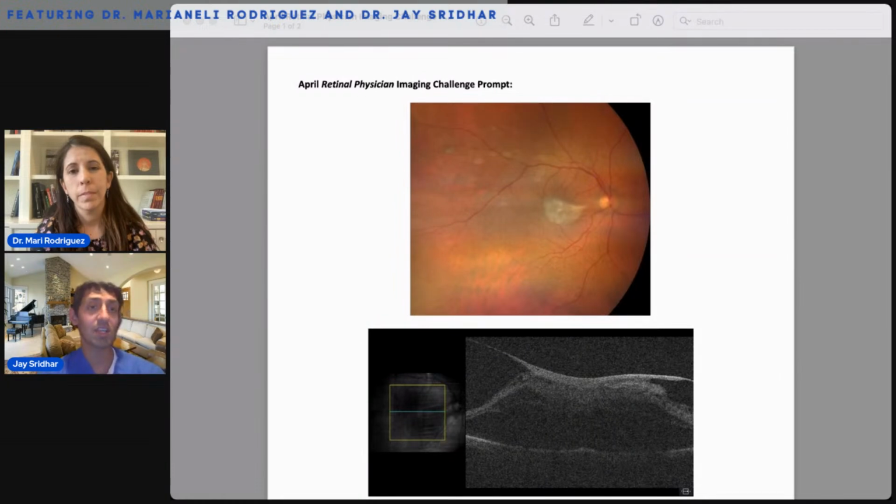Most patients in the studies we've learned, remember that number is like 75 to 80% of these patients, feel like they improve. They get some improvement, but it's not everyone. And if a patient hears all that and they're sort of balking, I don't push them into surgery. If I saw this person and they were kind of like, I don't know if I want to do this yet, I say, look, it's not an emergency. This has been there for a while. Let's repeat a scan in a few months.